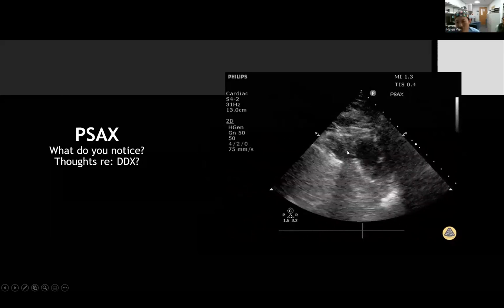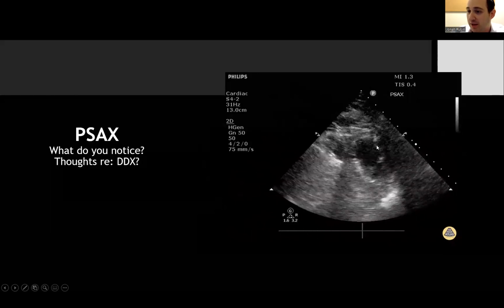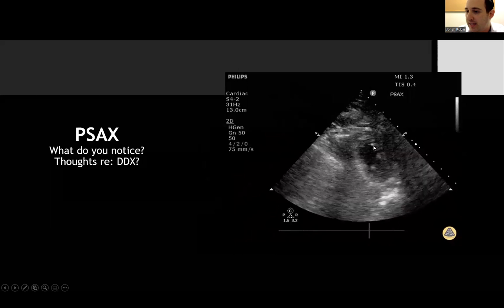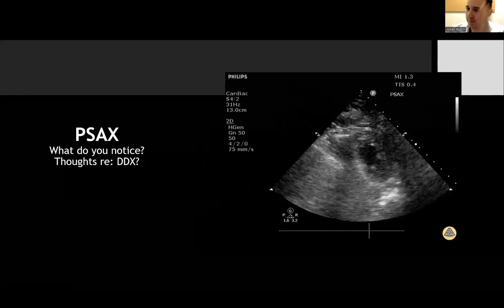I thought that was because of the motion of the patient. Yeah, so that's one possibility, right? As the patient breathes, the apex could be coming in and out of view. If that were the case, then it could be that the apical level, or something closer to the papillary muscle level, might be sliding into your view. And if you still think it's a 100% EF, then it might actually corroborate some of the hyperdynamic function.